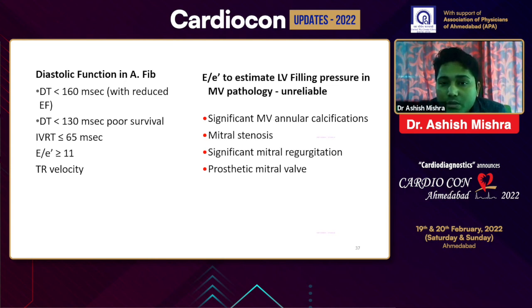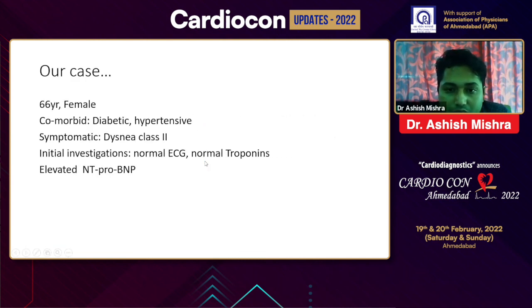E by E dash ratio to estimate LV filling pressure in mitral valve pathologies is almost unreliable. Some of the conditions that make it unreliable are significant mitral valve annular calcification, mitral stenosis, significant mitral regurgitation, and prosthetic mitral valve. The presence of these pathologies will hamper our assessment of LV filling pressures.